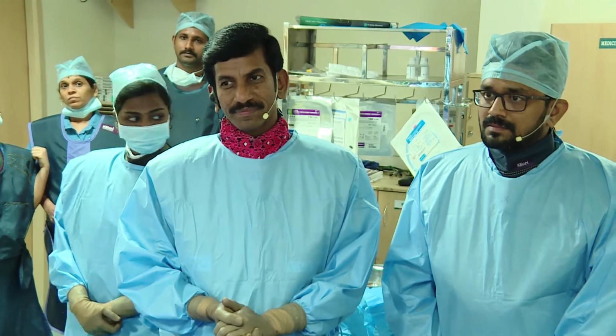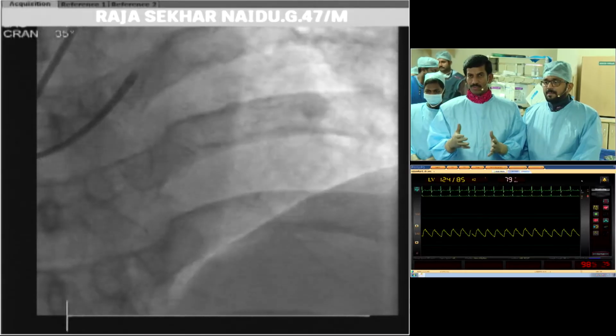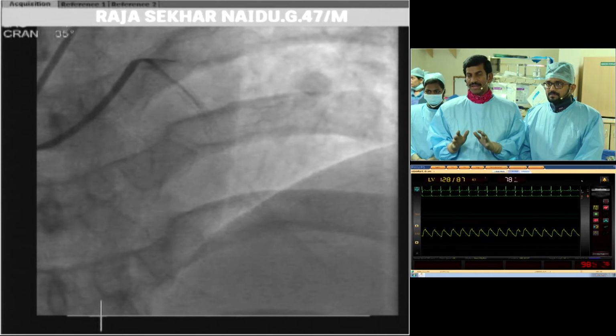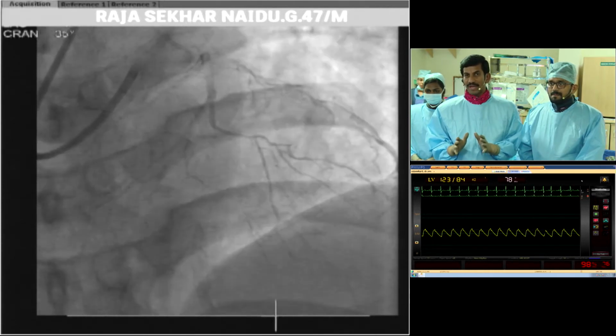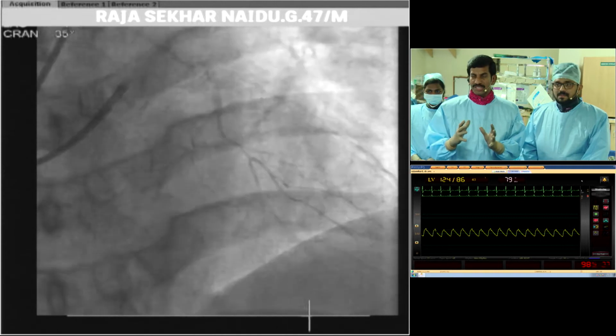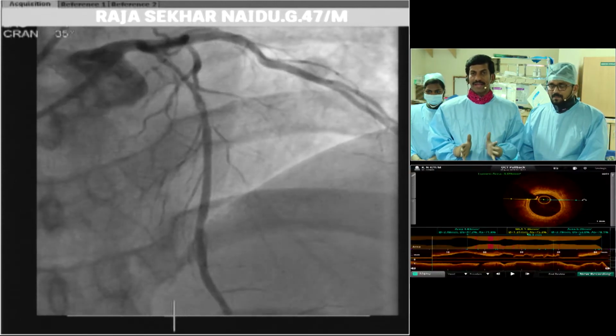Yeah, I agree. I think in cases like this, OCT imaging is crucial. I think it will provide a lot of information if that's available. So we want to proceed with the OCT. But one issue here is a 5-year-old DES. So the problem of uncovered stent struts where a pure thrombus has caused the entire problem is quite unlikely.